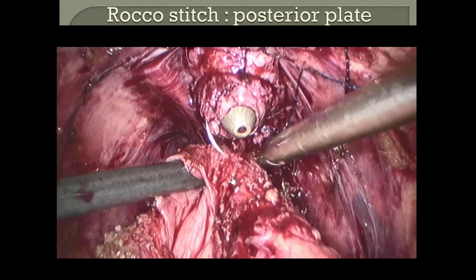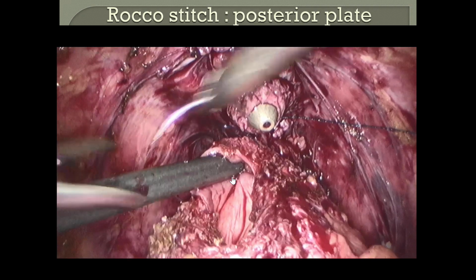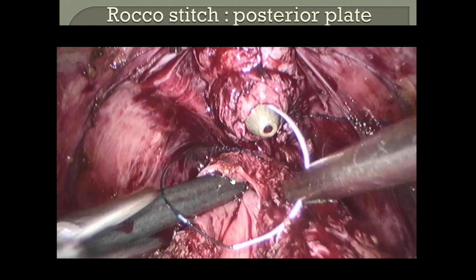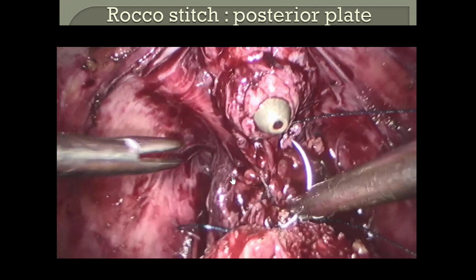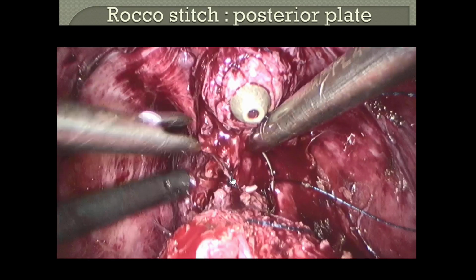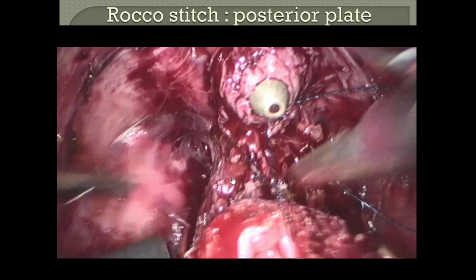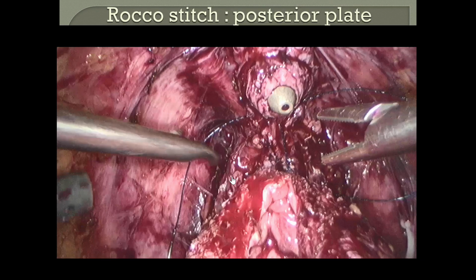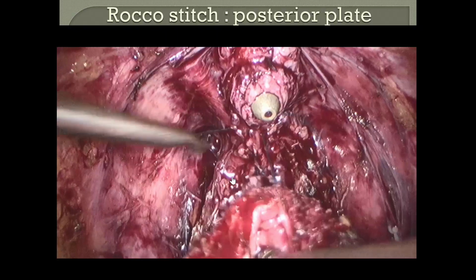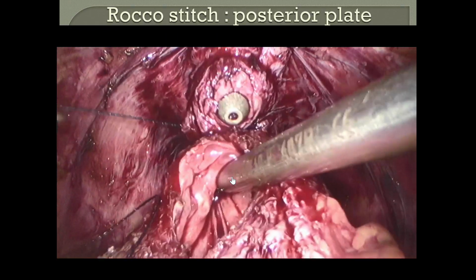and I will use the same thread. So it's a 23 centimeters of V-Loc. So I start by, I will go out on the left, you will see, and then I will do the anastomosis. And here, you see perfectly the muscle, you see perfectly the sphincter. So you see this aspect perfectly, and this morning we have seen it very well. Pay attention to this. Don't stitch the sphincter, never.